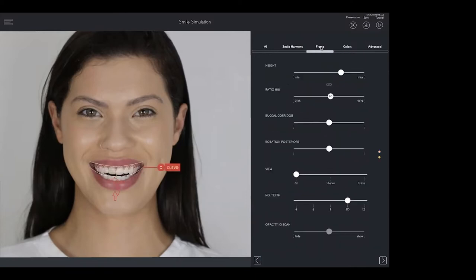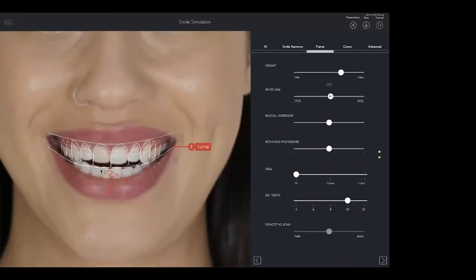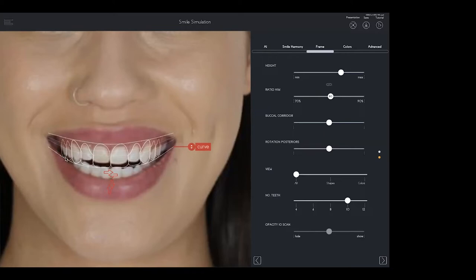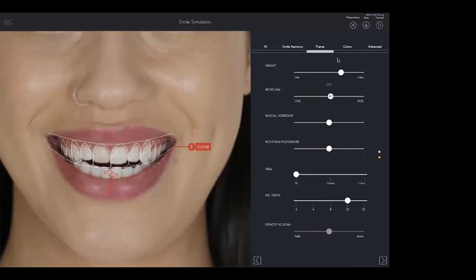I'll select the fourth option here on the bottom right corner. Then all I have to do is check on coloring, make adjustments such as reducing the number of teeth for my case, or select different tooth shapes. Why is initiating your dental wax-up workflow with a smile simulation important? It simulates the patient's smile and gives me a preview of what I could achieve. Notice this patient has an inverted smile — she's young with wrong tooth proportions on centrals, laterals, and canines. I also noticed she was not doing proper canine guidance but premolar guidance, which is totally wrong.